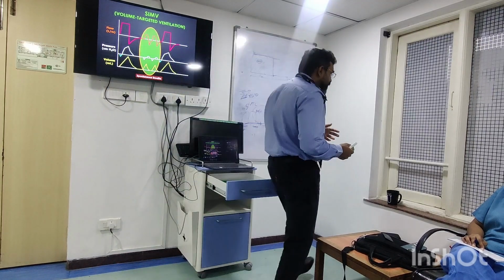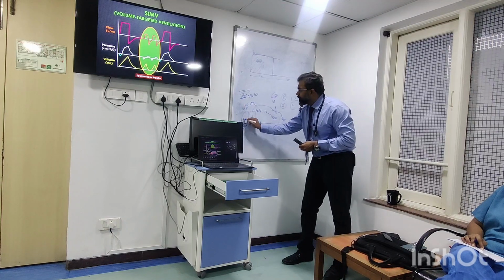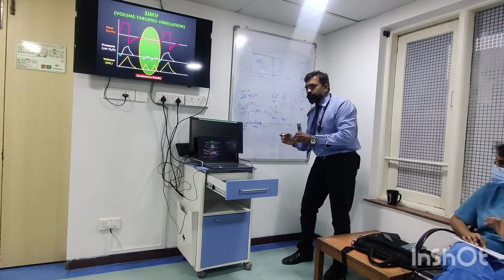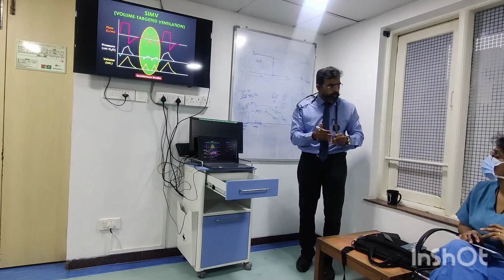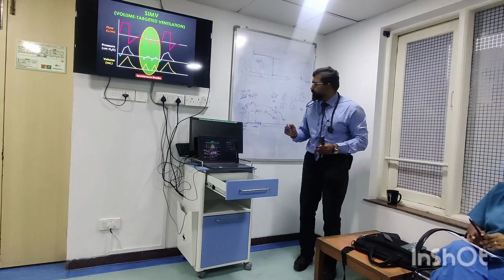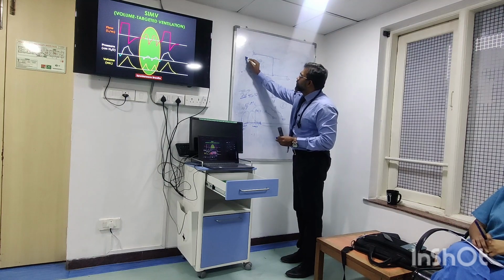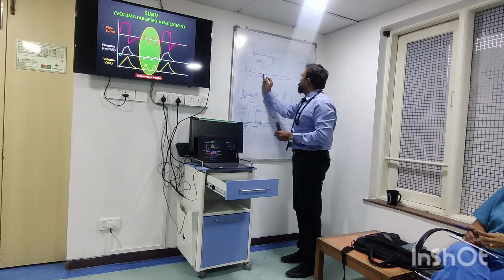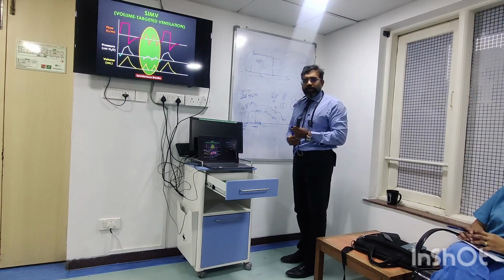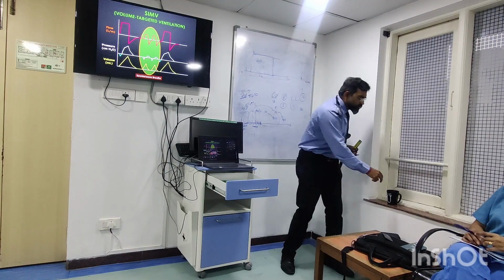If you want to understand what happens intelligently, say for example it breathes over here. Now some patients may breathe there and stop here. It will be a very long period. So what it does, by software, is move this phase variable downwards so that it doesn't really cause a problem. Otherwise you might wonder, once he breathes, then for a long time it will not give a breath. For example, this is my mandatory period, and this is my SIMV period. It takes a breath here and just stops here. Then I have a very long period where it is spontaneously breathing. The patient will get tired, no? You might think like that. What happens in this ventilator intelligently? It will move this phase variable inwards. And each ventilator has a different way to do that.